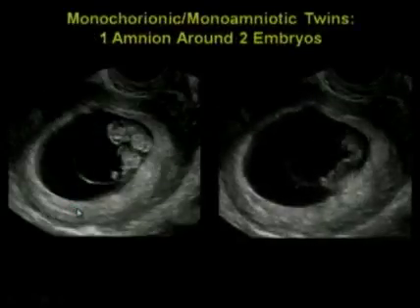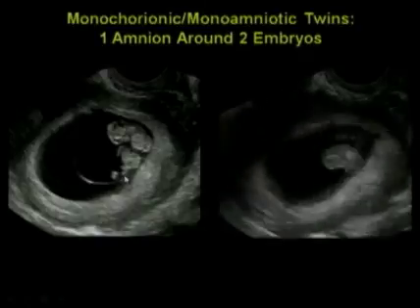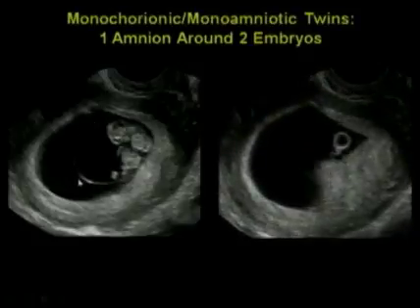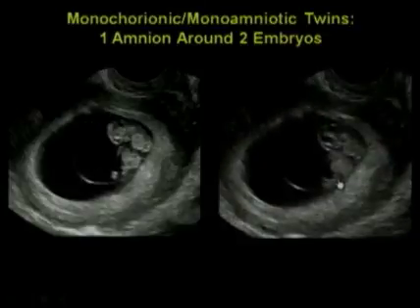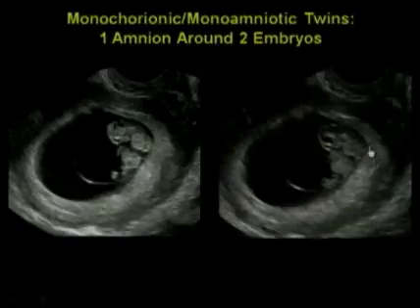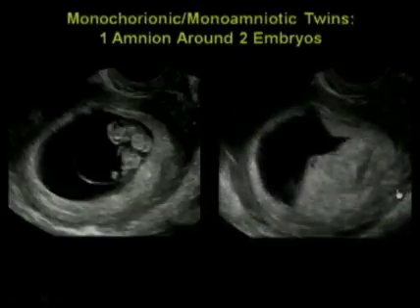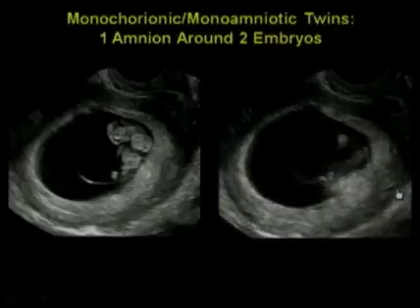Here are mono-mono twins in the first trimester — the rare ones. We know they're mono-mono partly because we see a single amnion all the way around them, and as we sweep through the pregnancy there's only one yolk sac seen. Since the number of amnions is almost always equal to the number of yolk sacs, one yolk sac means there's one amnion.